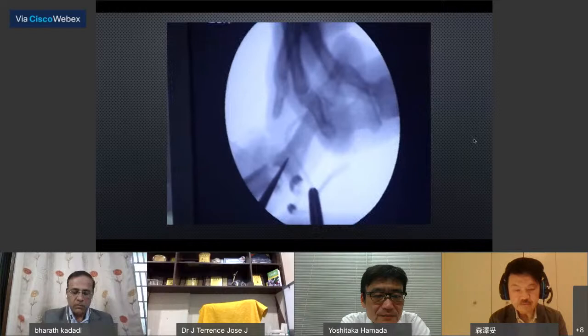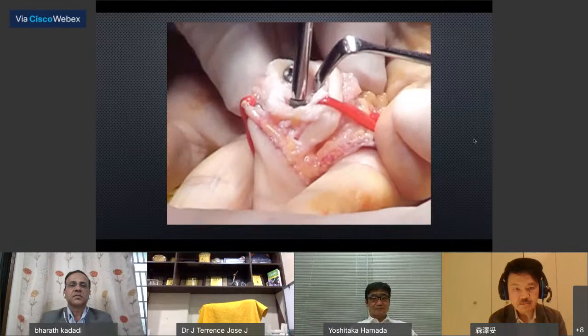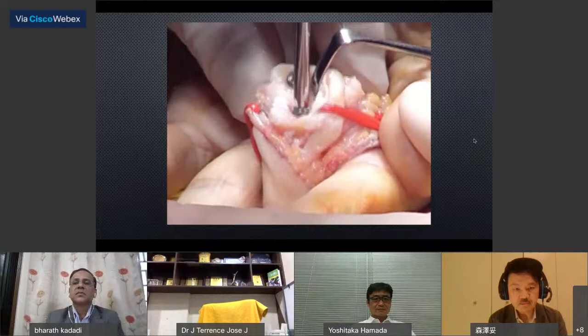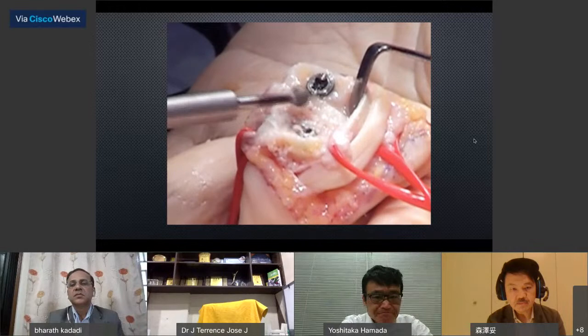Using X-ray helps us to make the hole at the proper position. Shave the bone around the joint anchor. Put a trial implant in and try to move the finger.